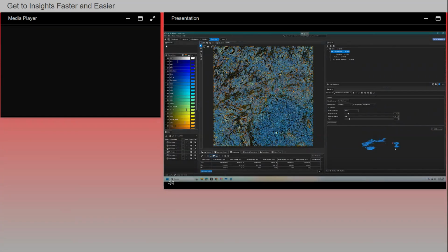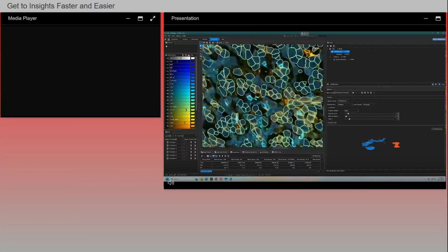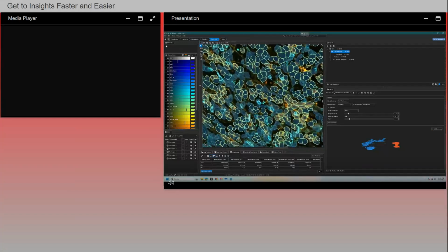What I'm going to do is I'm going to actually select this particular cluster, and my visual inspection shows me this is indeed, this is not the channel I'm inspecting right now. PKM2 is the correct one, so I'm looking at PKM2 and A1, and I'm going to turn off all the immune cells so that we're not confused, and GLUT1.